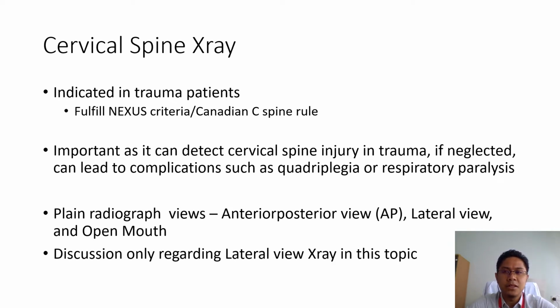If the patient is alert and conscious and can follow commands, we can always obtain plain radiograph views first, which involve the anterior posterior (AP) view, the lateral view, which is our context of discussion today, and an open mouth view, which is to view C1 and C2. I just want to remind you that the discussion is only regarding the lateral view X-ray in this topic.